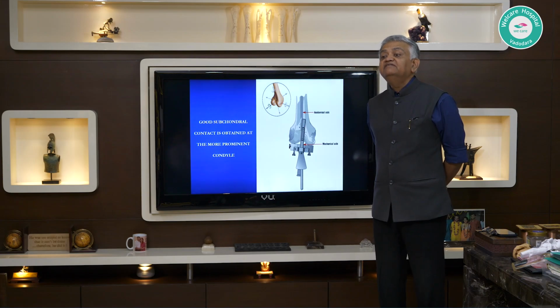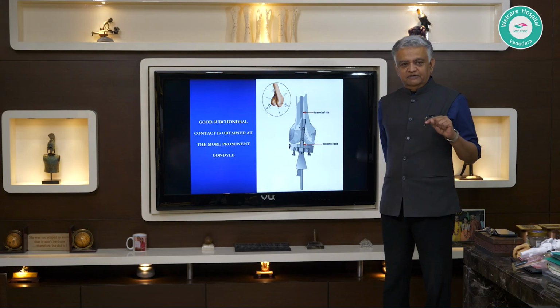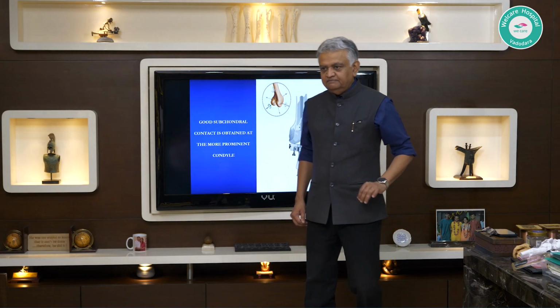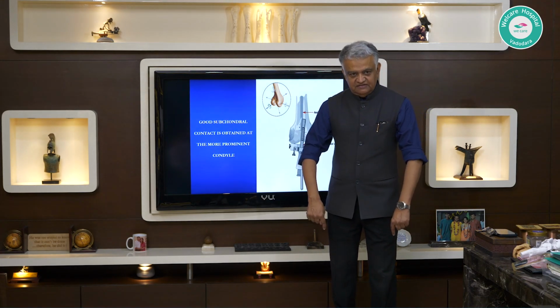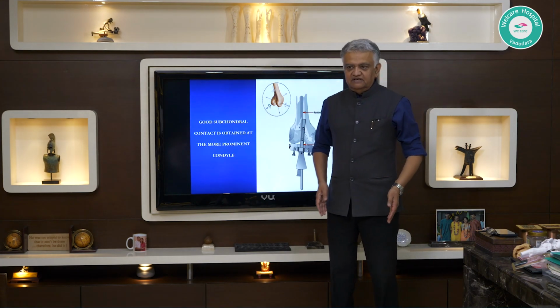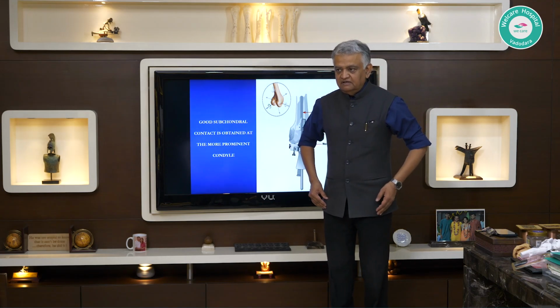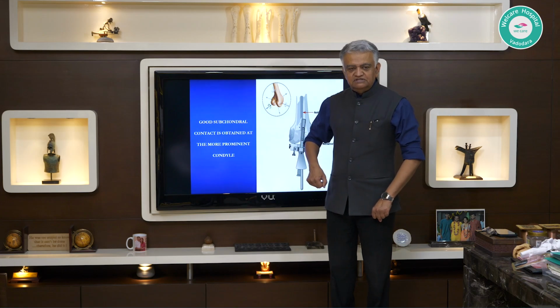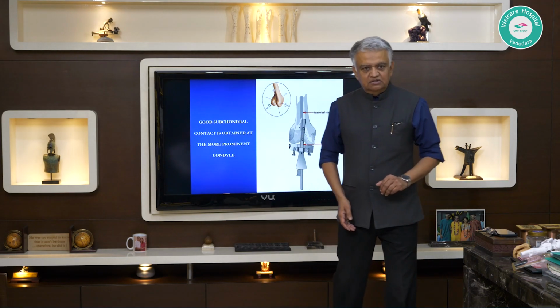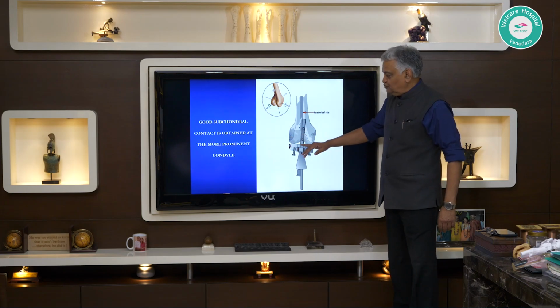Perfect. What a good question. And I think we debated and discussed this earlier, whether as part of this forum or at home or somewhere, and Arun Mullaji has written a good paper on this, that especially in the Indian women, the femoral bow is so severe that the anatomical deviation can be dramatic. 11 degrees, let alone 9. He has documented 11 and 13 in some cases. So do you really do all that much just to get your mechanical alignment perfectly right? I personally would not, because that would probably invade the lateral femoral condyle cut so high up.